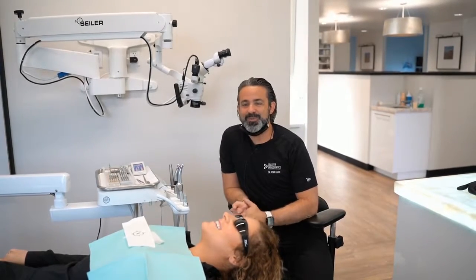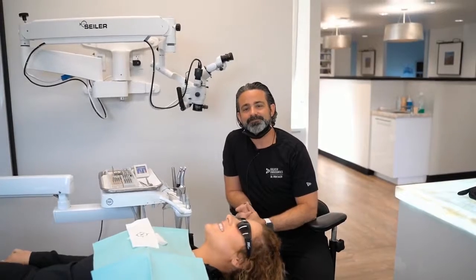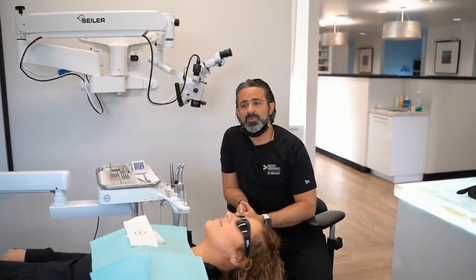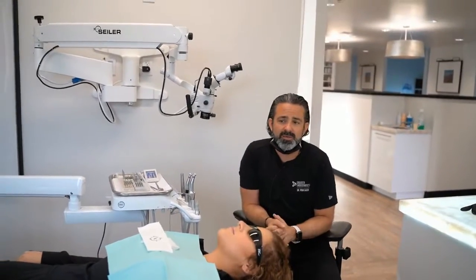All right, other microscope questions. Okay, this is Alex. Why did you choose this brand over the others on the market? So, there's always going to be a little bit of a personality to a microscope, and they all do have personalities. And with that personality, there's a cost. And the optics will always be an issue. Of the top tier brands, I think there may be some differences, but very little to negligible differences to what your comfort level is.